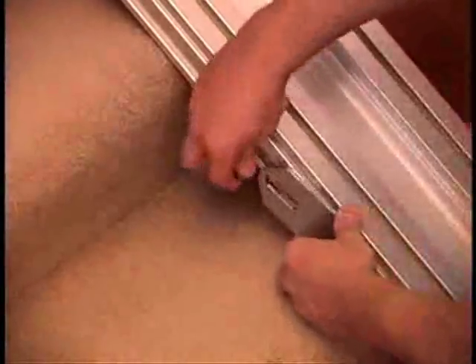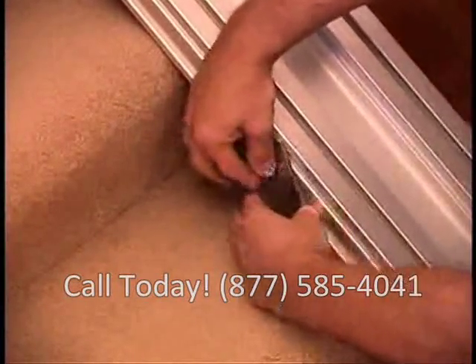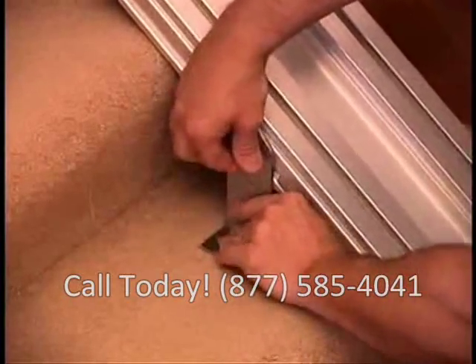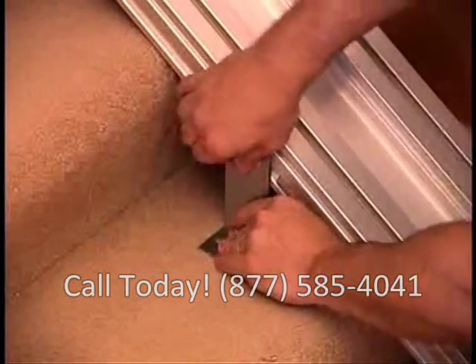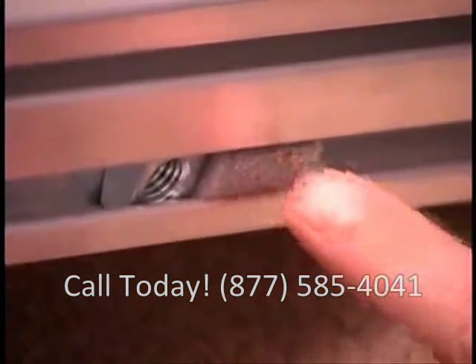Now attach track brackets — one pair above and one pair below where the track splices. Do not remove the foam packing beside the embedded nuts.